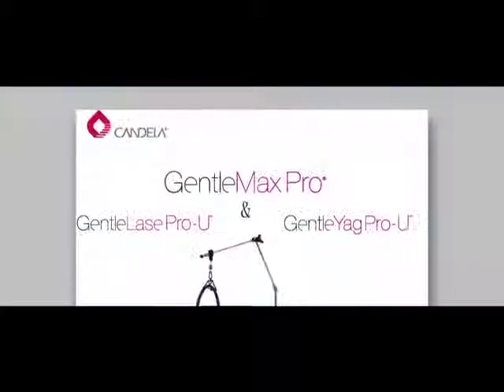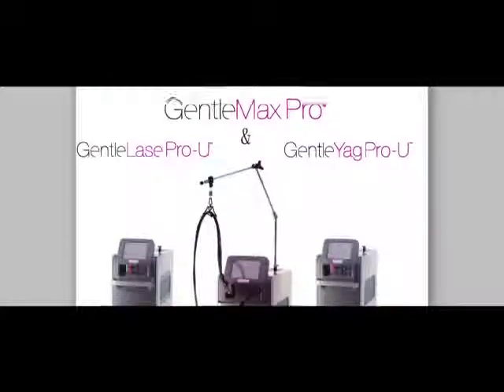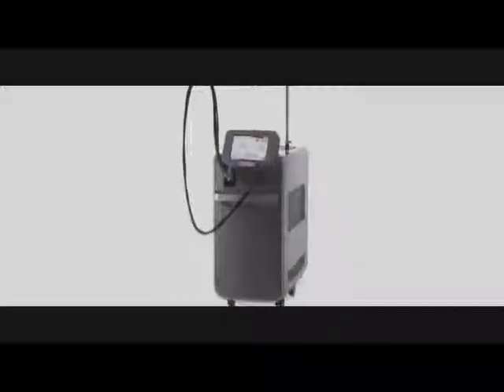Refer to the user manual when a fault appears. Note that the icon LVM is a portal to information for technical support. This concludes the instructional video for the Gentlelase Pro and Pro Series devices.